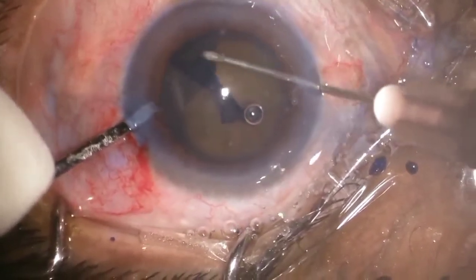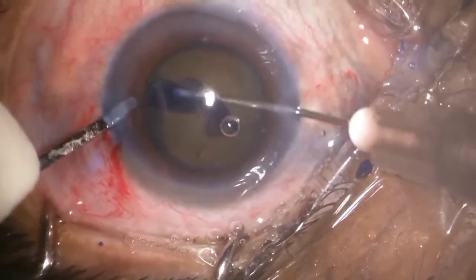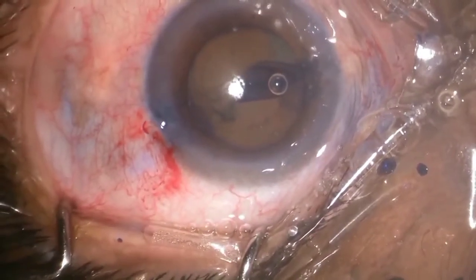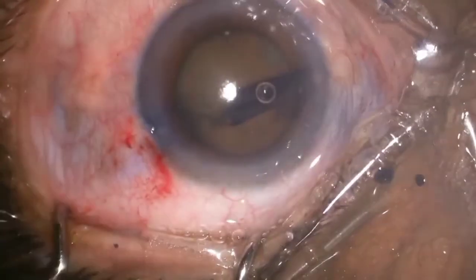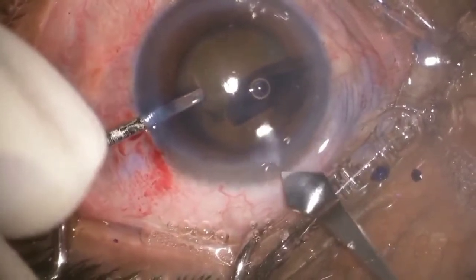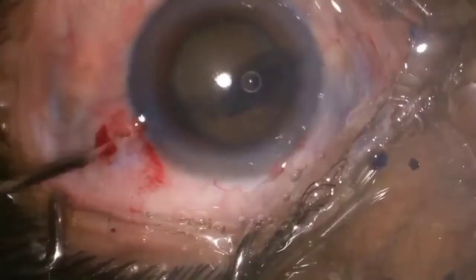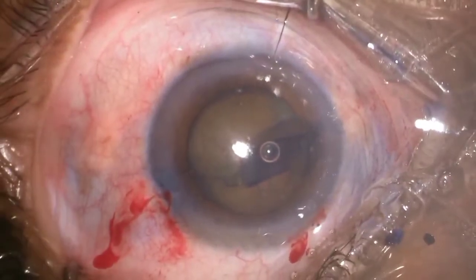I didn't use any pupillary expansion device because of two reasons. It was not available at the time in the OT, and the patient was very poor. Somehow they agreed to undergo hydrophobic lens implantation. So after again forming the AC with visco and finishing the rhexis, I made the main wound incision. It was a little posterior limbal approach, and I made it a triplanar incision, since it was a brown cataract.